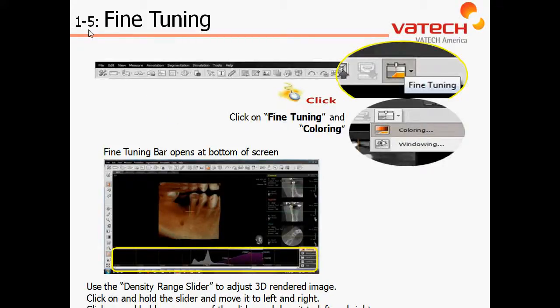Chapter 1, Section 5: Fine-Tuning. In this section, we'll review the ability to modify our 3D rendering, either by changing our density range, color range, as well as our opacity.